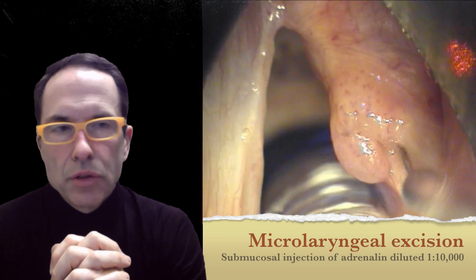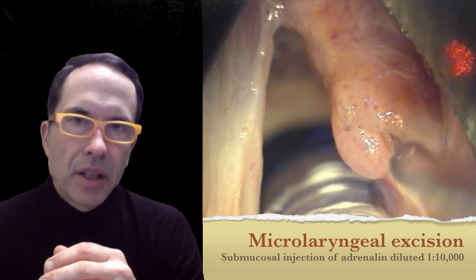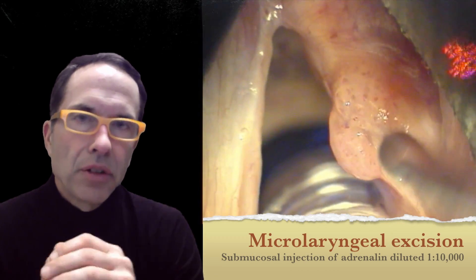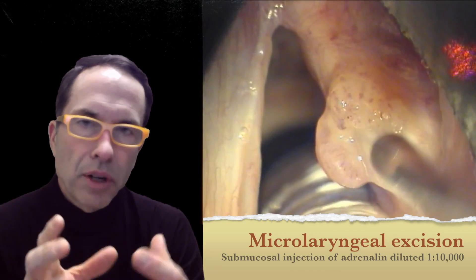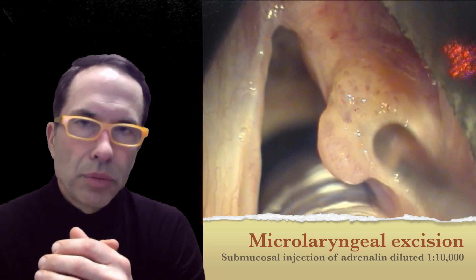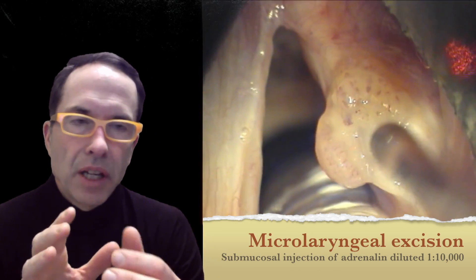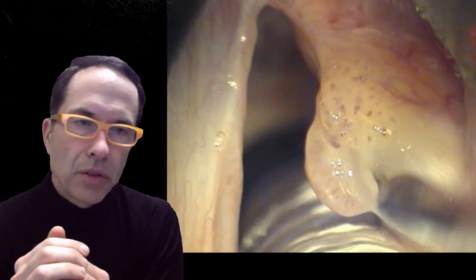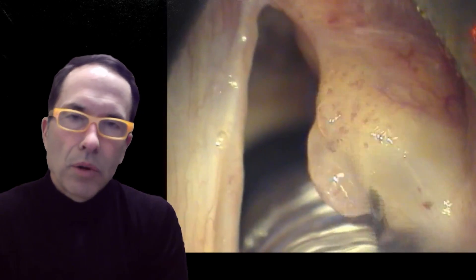The first thing I do to begin surgery is perform a submucosal injection. I'm going to inject adrenaline diluted 1 to 10,000 into the layer between the mucosa and the muscle. I'm trying to preserve as much normal tissue as possible — both the muscle and some of the submucosal tissue — and I want to remove the mucosa with the papilloma on it. This injection expands that middle layer so I'm more likely to save tissue.